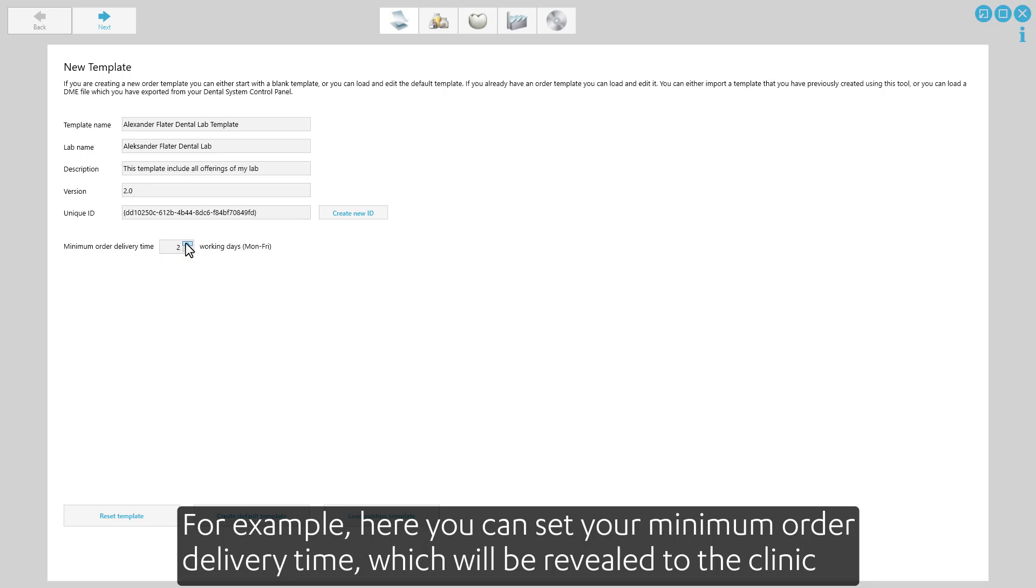For example, here you can set your minimum order delivery time, which will be revealed to the clinic.